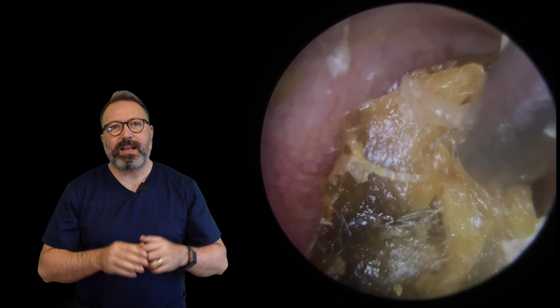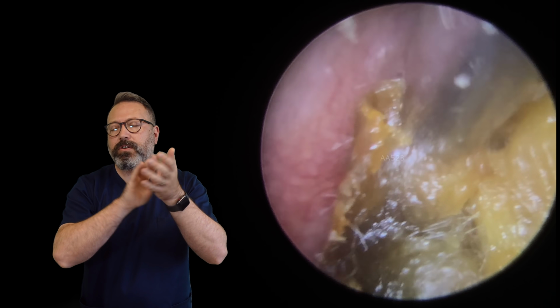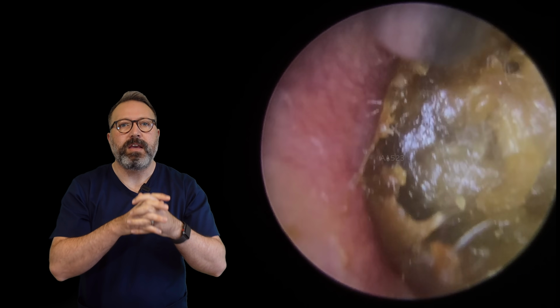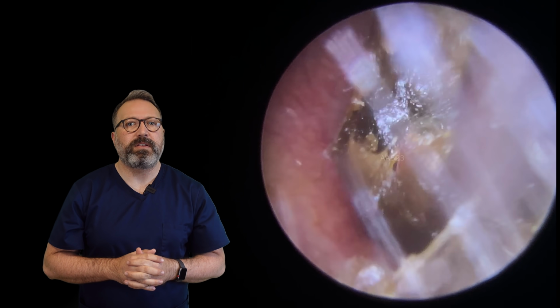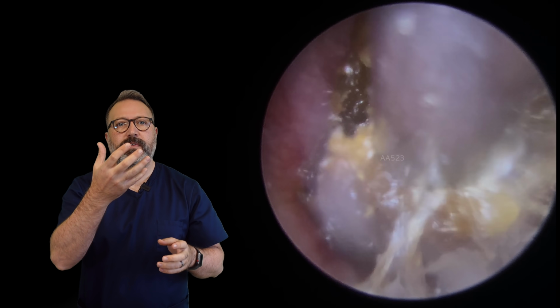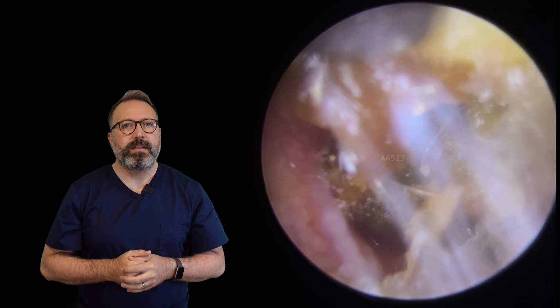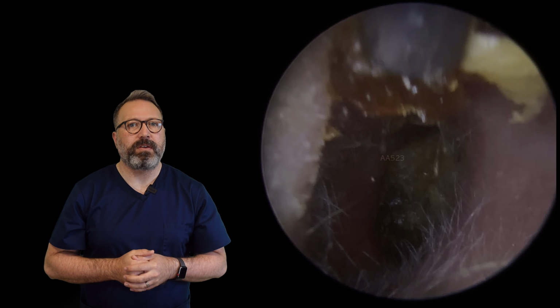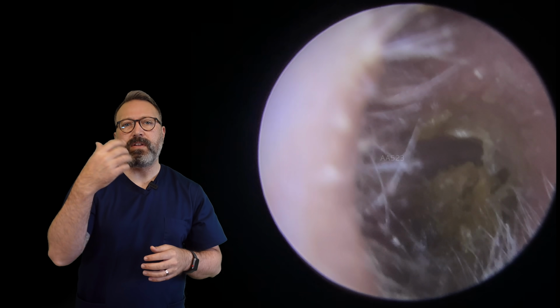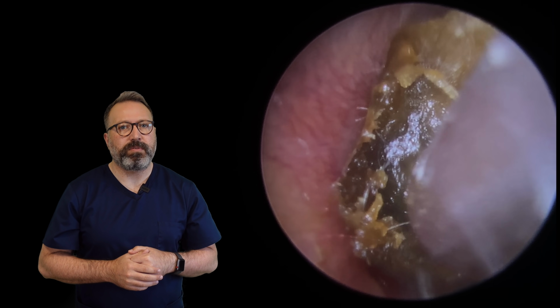There we go, and you can see that little ripple effect of skin there on the right-hand side. So we're just working along this much harder section here. You can see we've got a little tail of wax that came away a little bit further out towards the outer part of the ear canal there. So we're back in those cilia again. Let's draw that out. Looks like it drew some of the skin with it as well there. There we go, out that comes. So lots of little pieces coming away at the moment until we can break this really big central plug down.